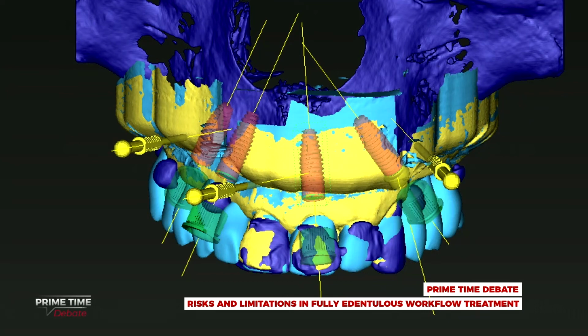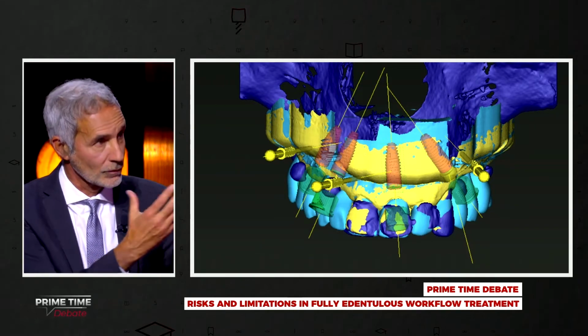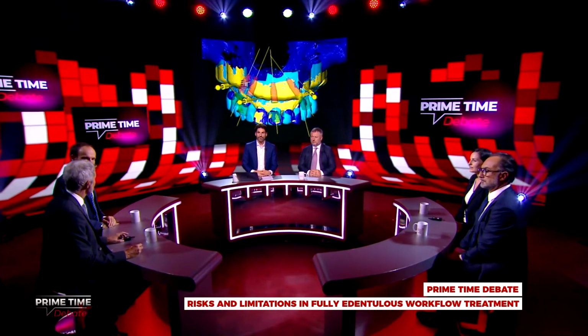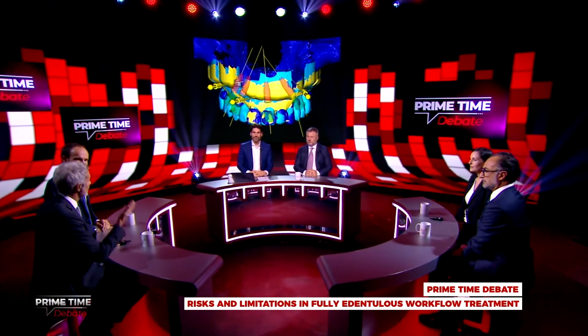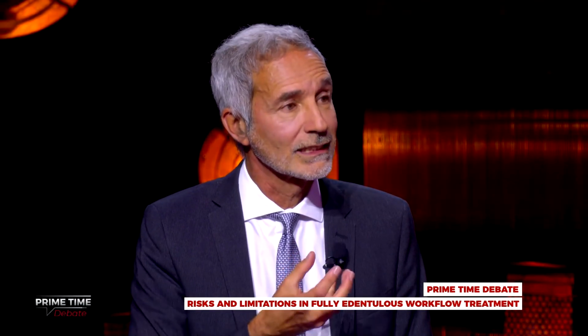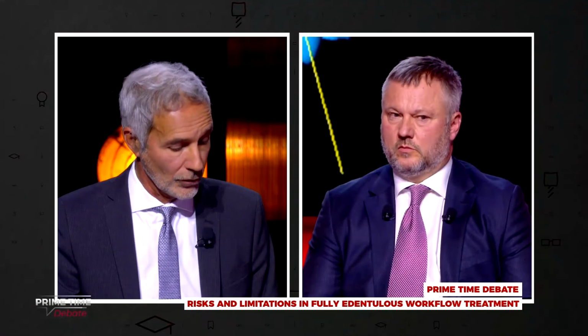We can scan this setup and import it into the software, and we can start to plan the position of the implant in accordance with the bone and also with the prosthetic plan, the choice of the abutments, the position of the sleeves, and the fixation pin if needed, as in this case. Even if we have the remaining teeth still in position that give a rest to the guide, we need fixation pins to help the stabilization. But this is one of the most beautiful parts of working with this digital approach in general. You have the full control.